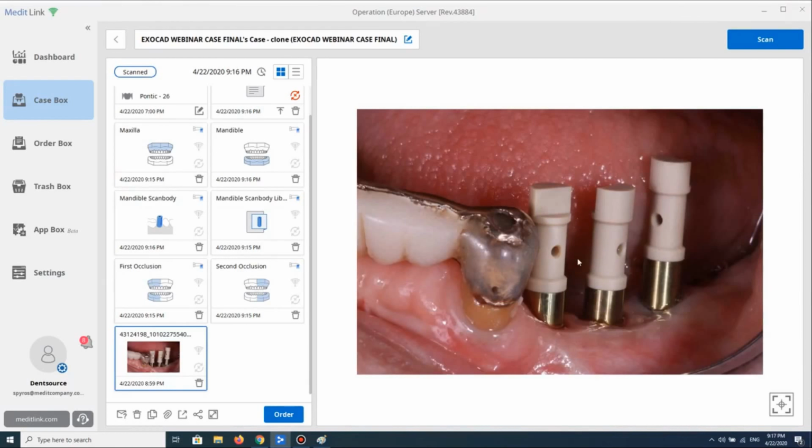So many of you would think that, okay, maybe it's better to take all the scan bodies in order to finish faster. Okay, but most of the times it won't be that beneficial as you might think. Okay, so please make sure to see with your eyes that you have sufficient space in order to rotate inside here the scanner in order to scan the scan bodies. Okay, and let's go now to see other 2 things that you can do.